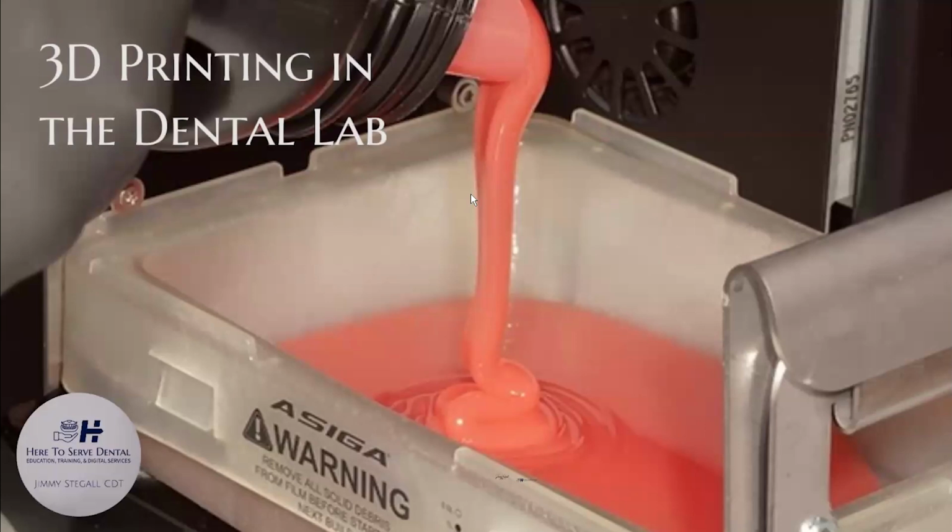Now, in the Asiga line, there are some settings in print jobs. It's called fast print mode and separation detect. And some resins, you really can't check the separation detect, and we want to check it because it makes the print job go faster. If you do check it, you gain speed. But in some resins, it also exacerbates the problem of misprints.